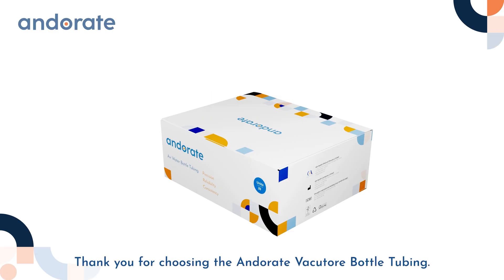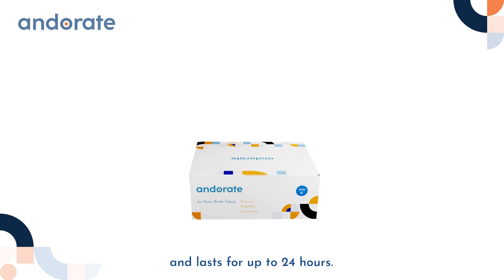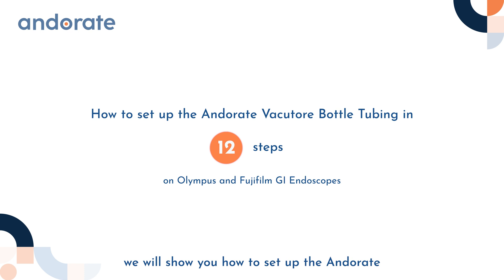Thank you for choosing the Anderate Vacuator bottle tubing. This product is ready to use and lasts for up to 24 hours. In this video we will show you how to set up the Anderate Vacuator bottle tubing in 12 steps for GI procedures on Olympus and Fujifilm GI endoscopes.